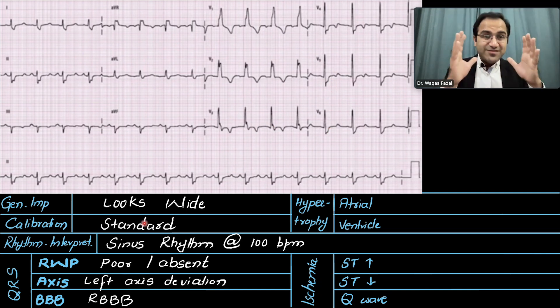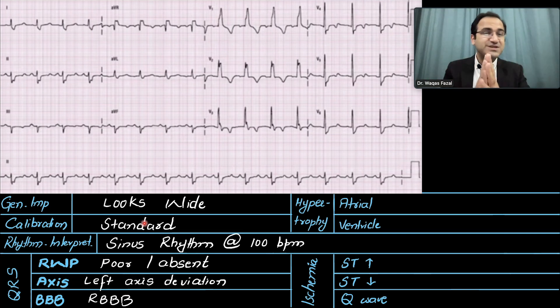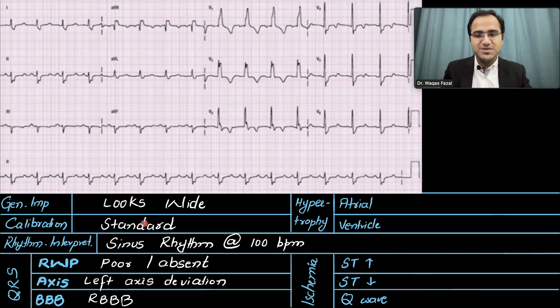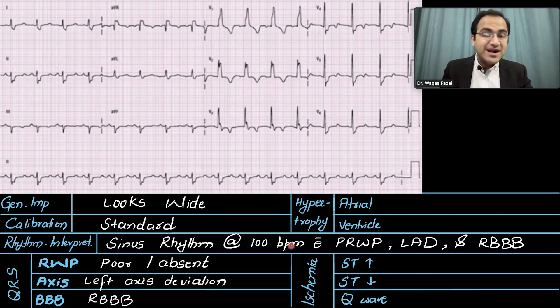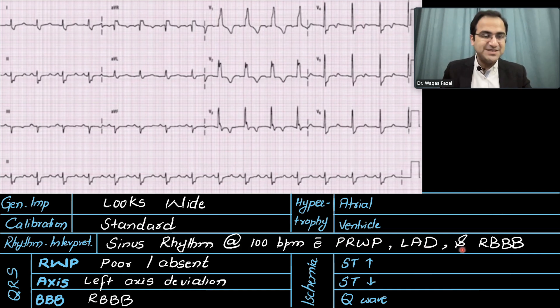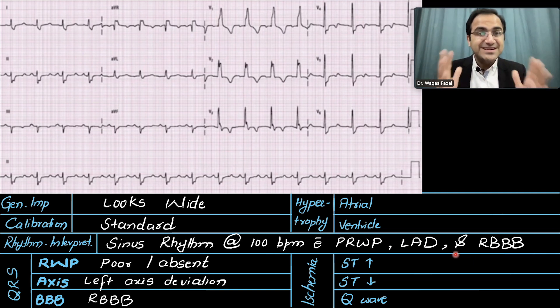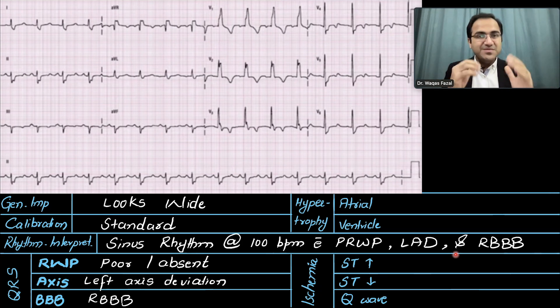If you are getting confused by R wave progression and axis, I have discussed everything in my previous videos — check those out to learn everything about ECG. We will interpret this ECG as sinus rhythm at 100 beats per minute with poor R wave progression, left axis deviation, and right bundle branch block. That is the beauty of the 6-step method — we are commenting on each and every finding.